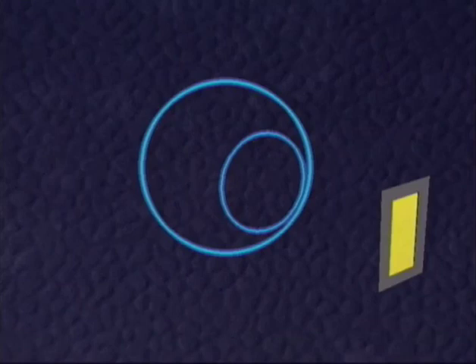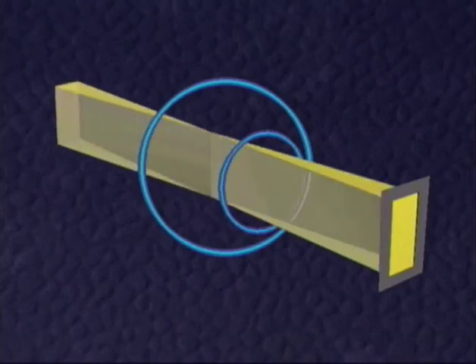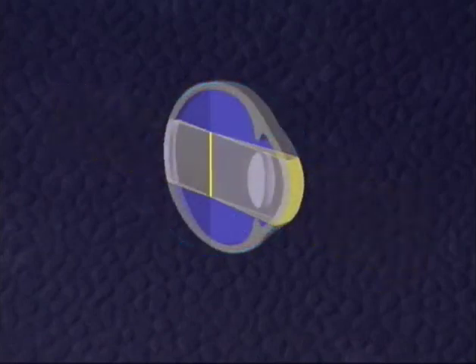How is an optical knife generated? From a diaphragm with a brightly illuminated narrow slit, a beam is projected into the eye so that the image of the diaphragm is focused at the place chosen by the examiner. But note, the optical knife does not only consist of the focused slit image. In addition, the divergent parts of the light beam in front, as well as those behind the focus, are used for the optical dissection.